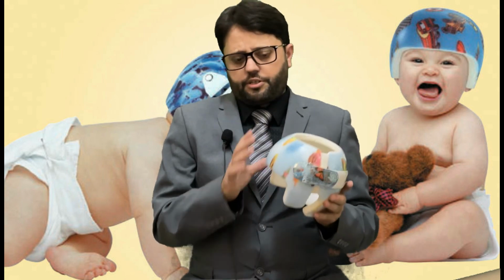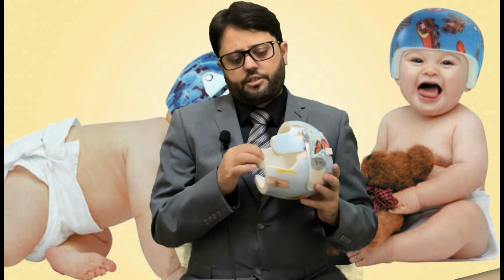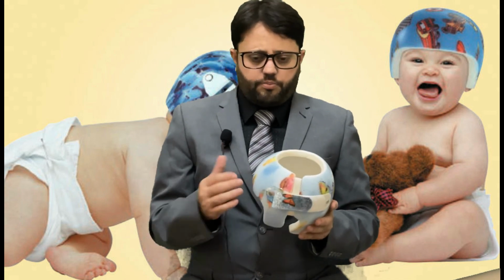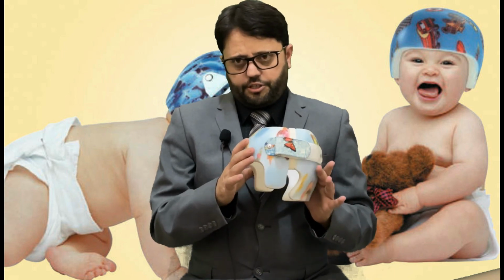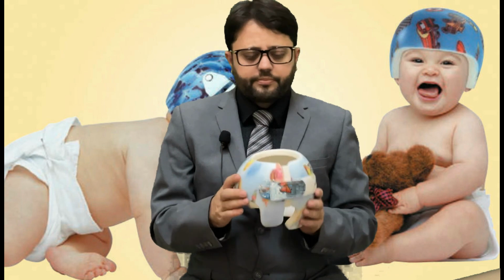In some cases, if it becomes a little tight after 2 to 3 months due to overgrowth of the baby, we need to adjust from inside, because the foam is very thick, 10 to 12 millimeters. So we have enough area to modify it. Once the modification is done, it can be a journey of 3 to 4 months. We check up every 2 weeks, then after maybe 3 weeks, in some cases even after 1 month. Once we finish our treatment, we get a very nice rounded skull shape.